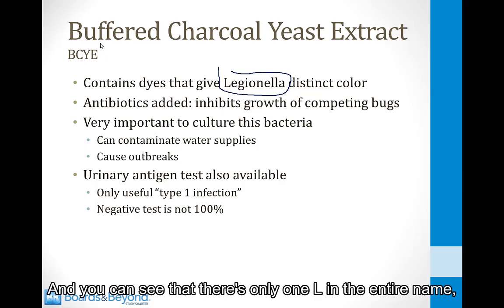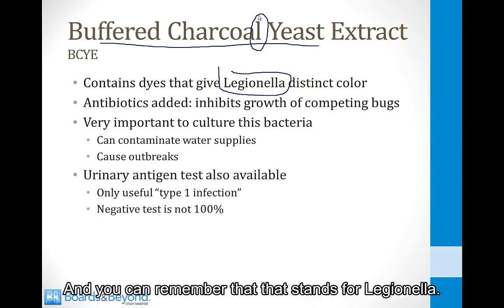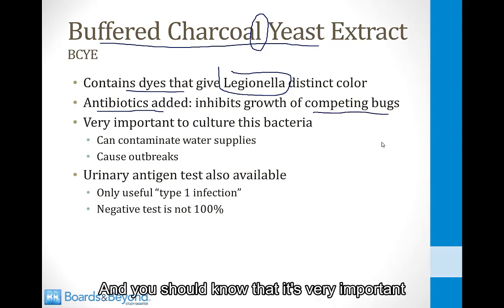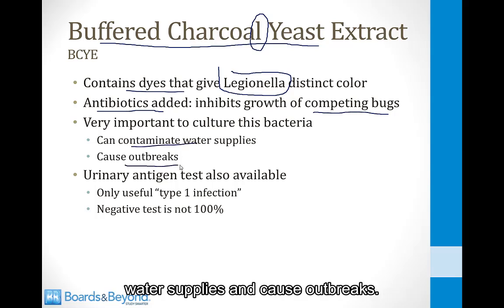And you can see that there's only one L in the entire name. That's at the end of the word charcoal, and you can remember that that stands for Legionella. It has these dyes that give Legionella a very distinct color. It also has some antibiotics added so that competing bugs don't grow. And you should know that it's very important to culture Legionella because it can contaminate water supplies and cause outbreaks.